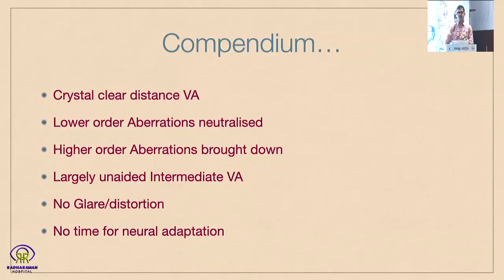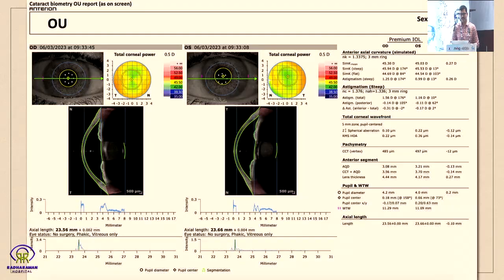And when it comes to the trifocals and the EDOFs and we talk about neural adaptation, I'm a busy practitioner. I cannot afford any time to be given for this so-called neural adaptation to take place. I want my vision bang on the very first post-op day. I can't afford time for that. So let's get on to my measurements.